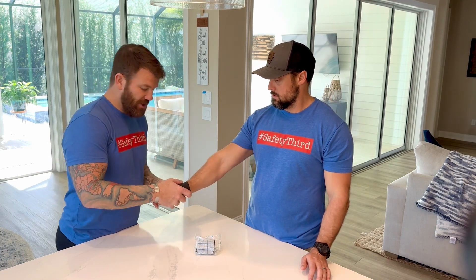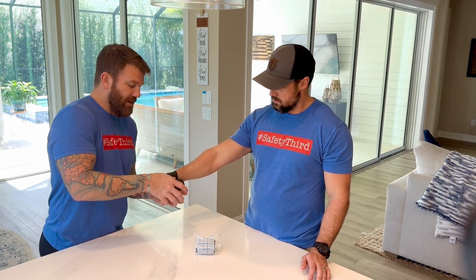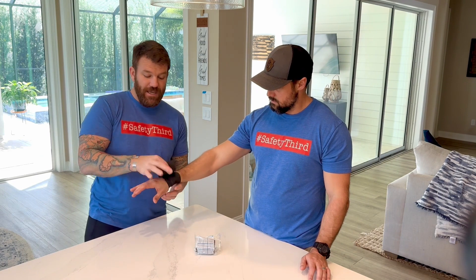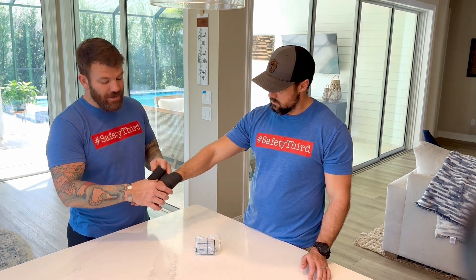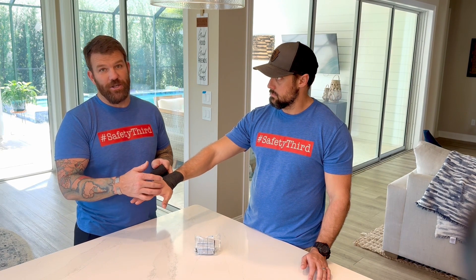And the best part about it is that it sticks to itself. So if you've got a wrist sprain, you can get it down by the wrist and it immediately sticks to itself. It's kind of hard to see in the video, but you can use this as truly kind of an ace bandage type material.